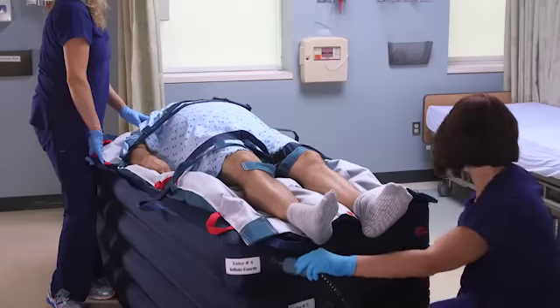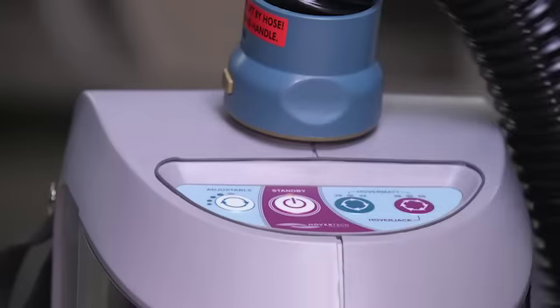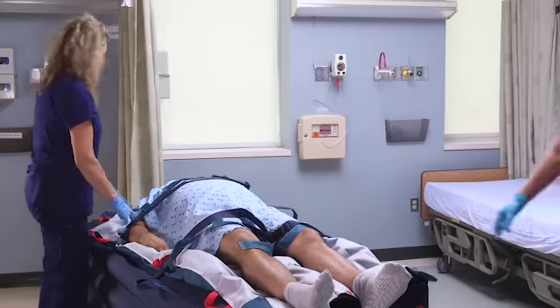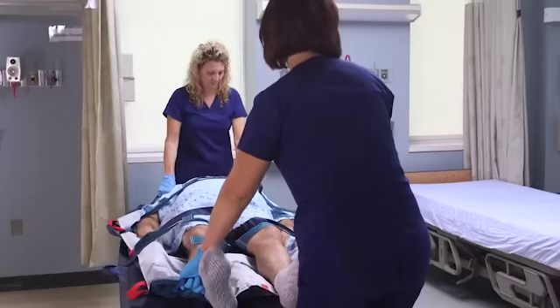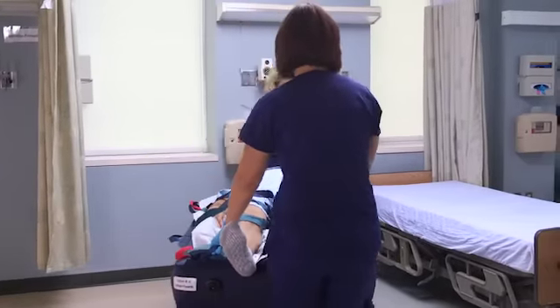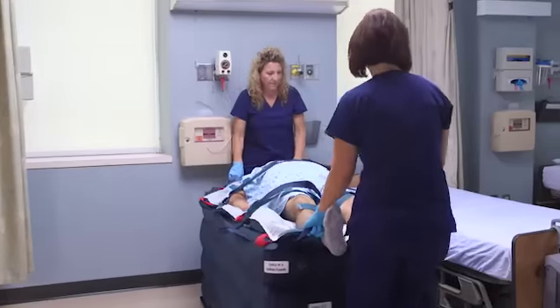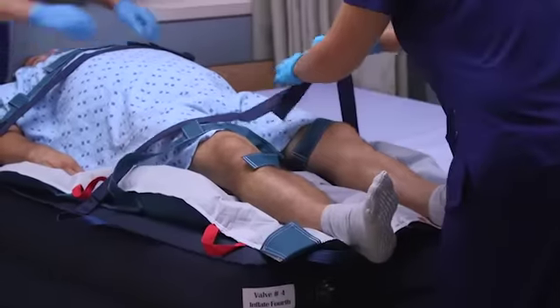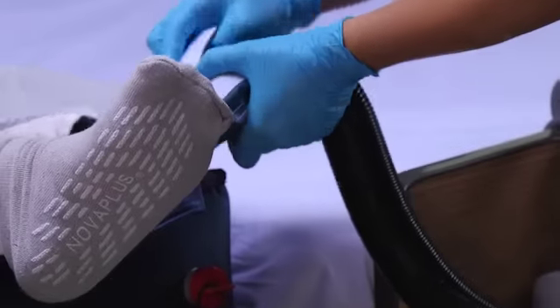Once all chambers are fully inflated, press the standby button on the air supply to turn off the airflow. Bring a bed or stretcher alongside the inflated HoverJack, or use the perimeter handles to slide the HoverJack next to the bed or stretcher onto which the patient will be laterally transferred. Adjust the bed height prior to the patient transfer so that it is slightly lower than the top of the inflated HoverJack.